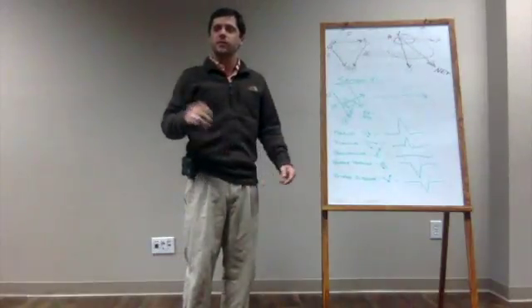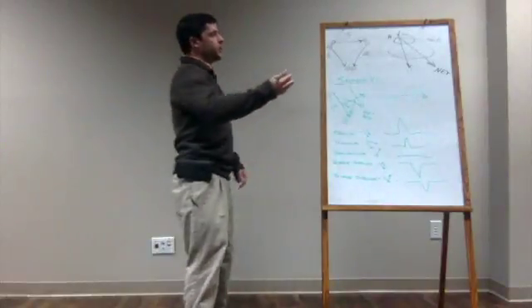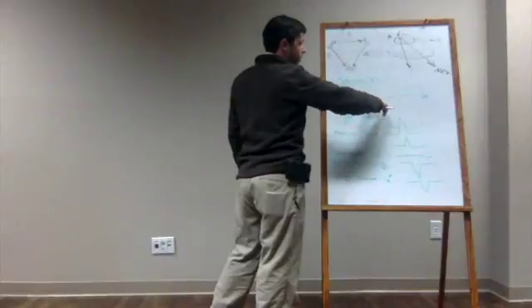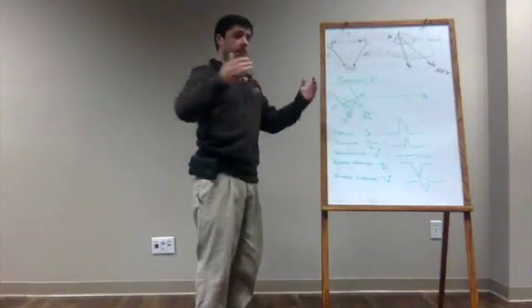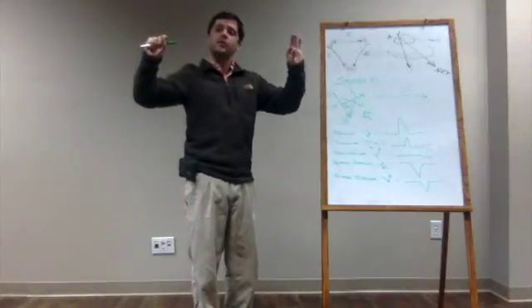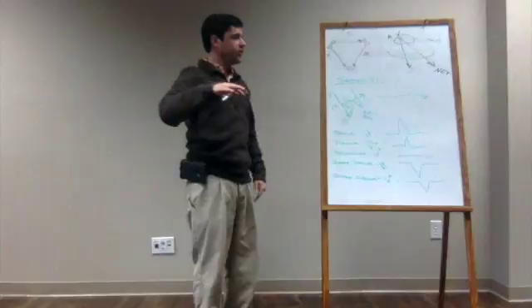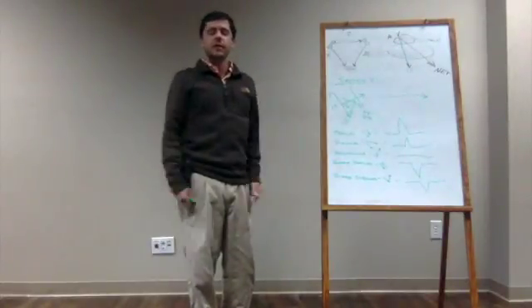If that makes sense. How do you determine what your baseline is? The baseline we also call the isoelectric line. So if a patient is in asystole with zero activity whatsoever, you're going to have the flat line. That'll be our isoelectric. Once a conduction is picked up in an EKG, that is where we'll have deviations that are both positive and negative.